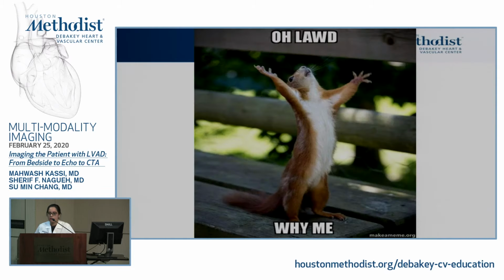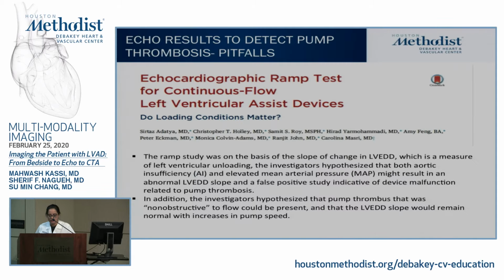So I know this is what most people experience at the time when we are doing ramp studies, but like I said, most of them were done for determination of effective unloading most of the time, and less for pump thrombosis. Most of the pump thrombosis diagnosis is made clinically.